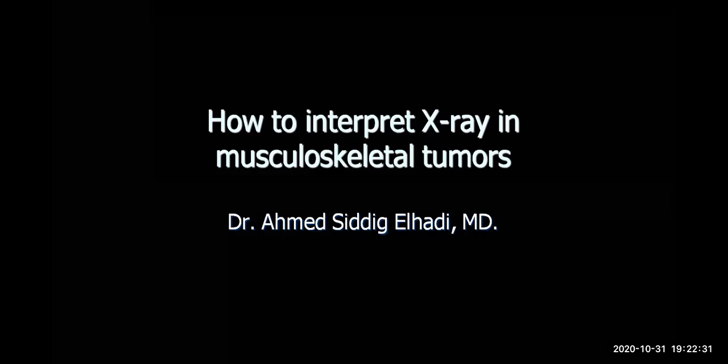Actually, this topic is very important for all orthopedic registrars and orthopedic surgeons. And its level is undergraduate, unfortunately. But we know most registrars don't know how to read X-ray in bone tumors, unfortunately. This is why we prepared such a talk, to help registrars and guide them to reach a possible diagnosis from just X-ray. It is a very important step in musculoskeletal oncology.